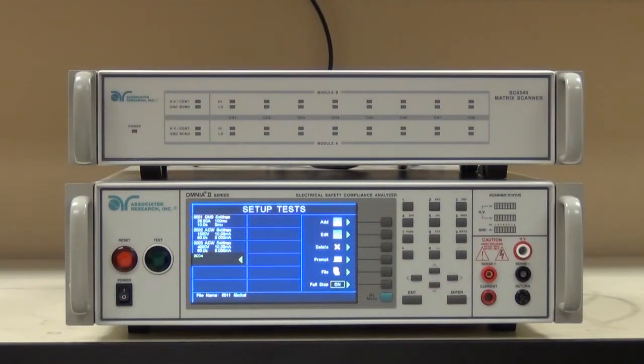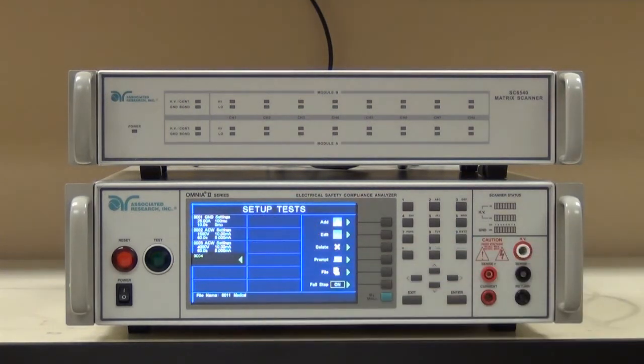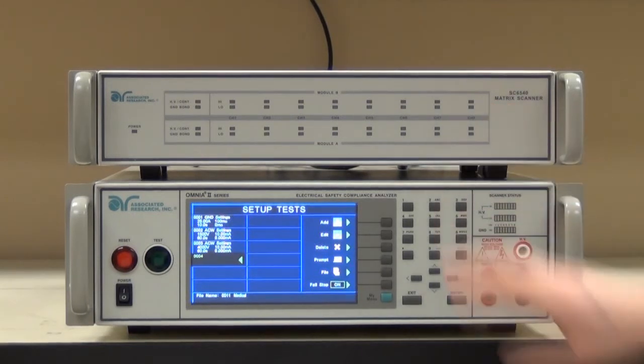To finish up this testing sequence, we need to add a series of line leakage tests. As you can see, we already have the ground bond and the two high pot tests. Then we're going to install a series of earth leakage tests, followed by a series of patient general leakage tests — which basically means measuring leakage from the patient lead back to the system reference. And then we're going to finish up with what's known as patient auxiliary testing, which is patient lead to patient lead leakage. There are two patient leads on this particular DUT, so we're going to connect those via the scanner and run our leakage tests.